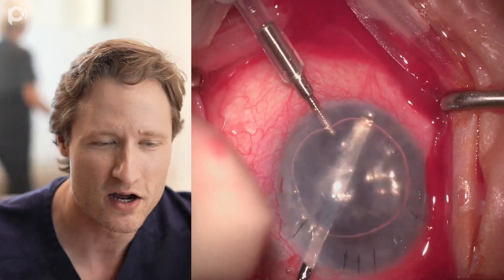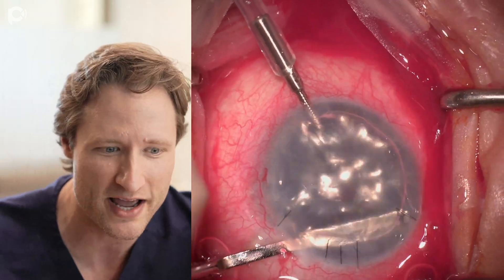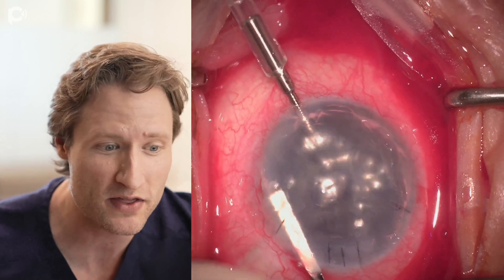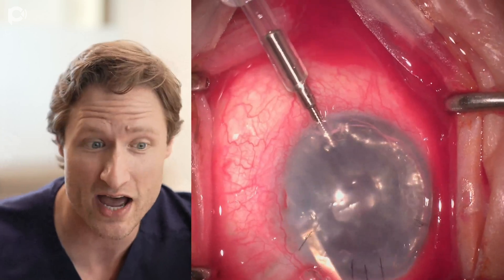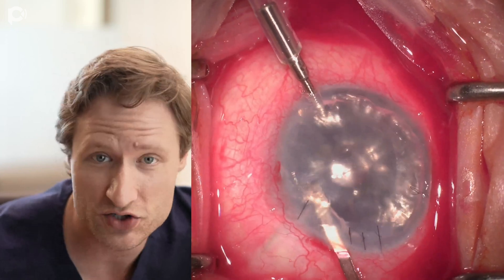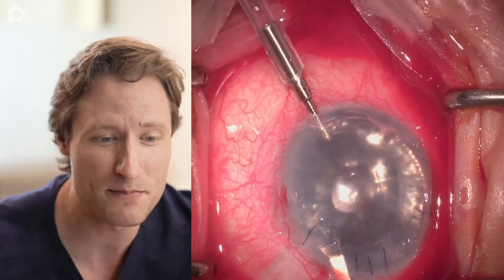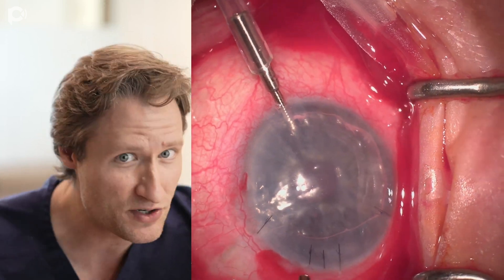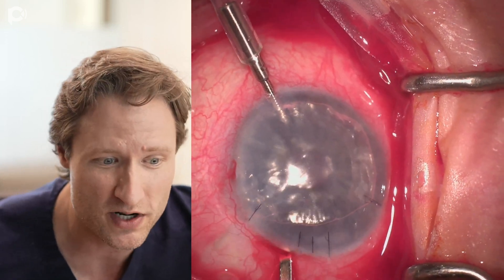I'm stripping initially with that inverted Sinskey hook and now with a Mela scraper through the main wound. One thing I want to call your attention to is how unstable the anterior chamber is. The chamber is constantly collapsing as I'm doing this — and it's not just because I'm using the main wound.